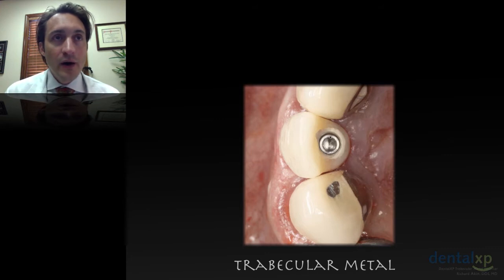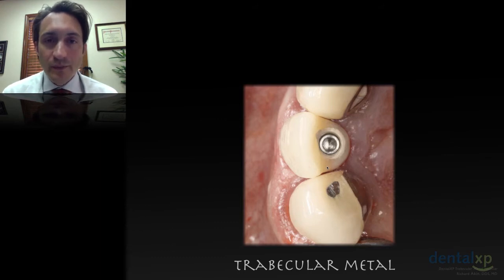Here we have our short abutment screw, temporary abutment screw, our composite, and the denture tooth. And these are all one unit, delivered as one unit. I am usually not too concerned about the lingual or palatal aspects of the provisional. I only want it to serve as a socket seal, and the palatal aspect of it needs to be contoured and smooth, but is not where most of the work goes into.